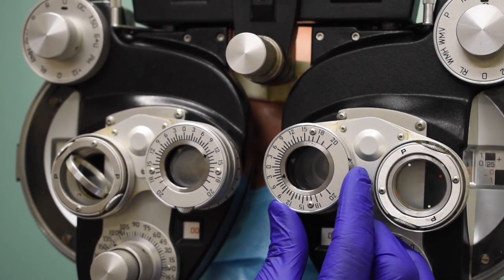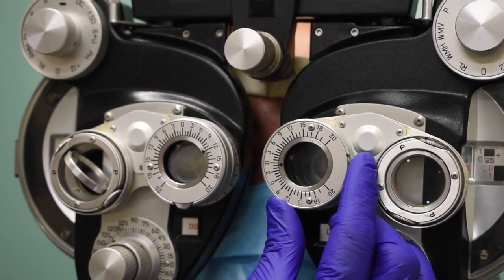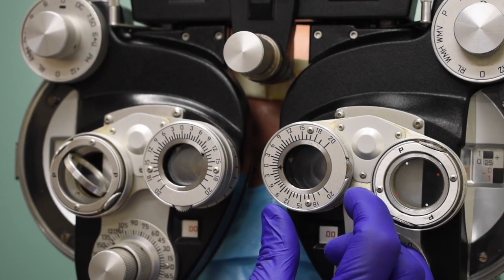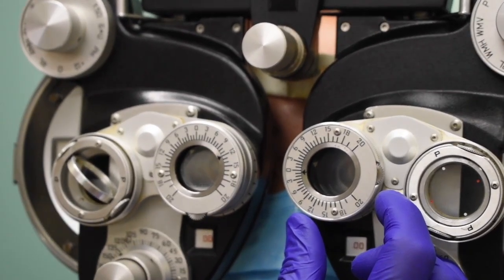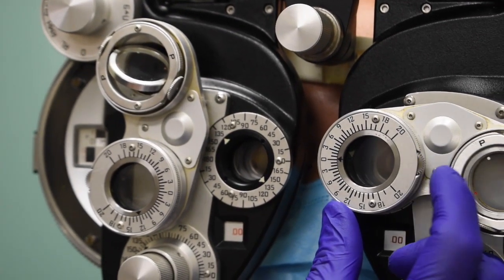There. Good. I'm going to go past. Tell me when they line up again. There. Good. So I've got 0.5, 0.5 left base down. Close your eyes, Phoebe.